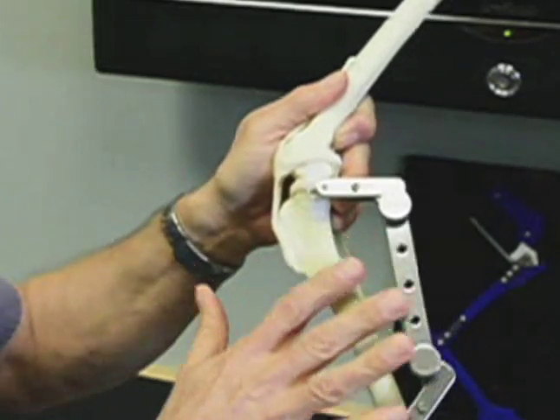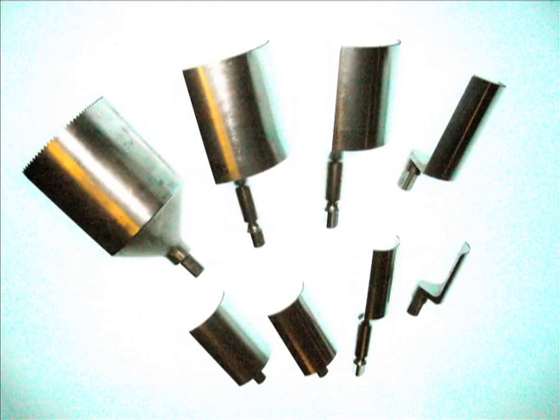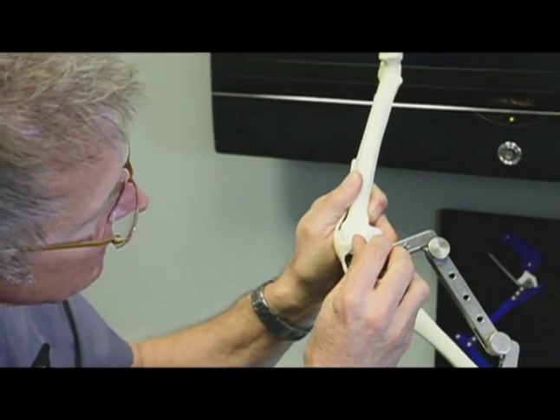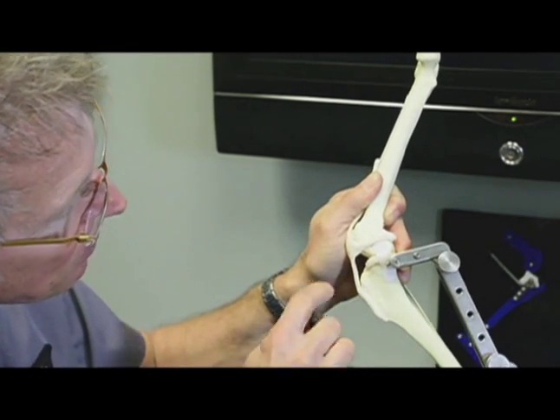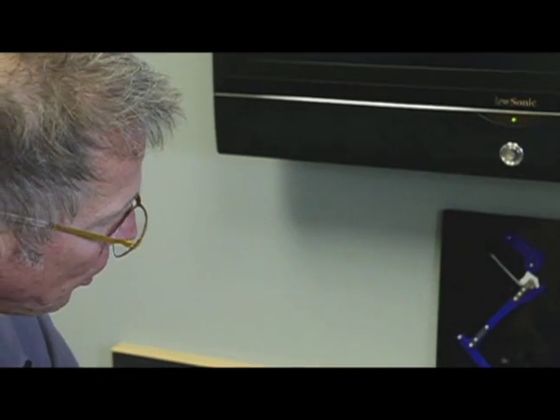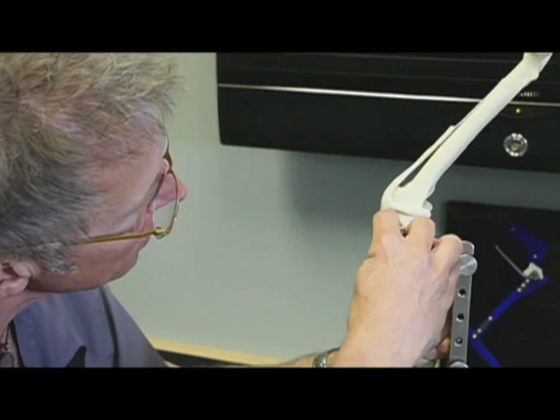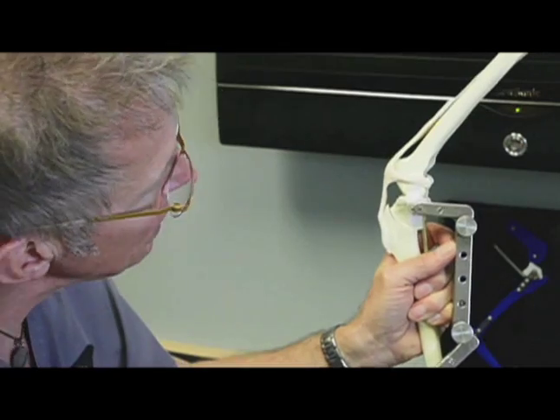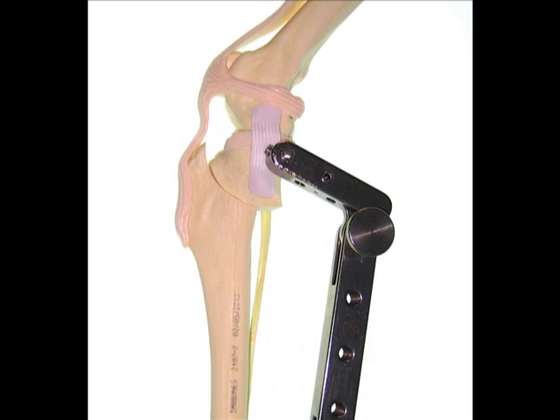So once we have the jig in place, then we'll use an oscillating saw. We have a variety of these saw blades, in fact about 10 different sizes, and we can place them appropriately on the bone, and they just vibrate and oscillate in a fine motion to make a very precise cut. So that's what the next model shows. We've performed the osteotomy, and you can see where it was performed, and we see that section of bone now we can rotate. Based on preoperative measurements, we rotate it an appropriate amount, and then with it in that new level position, we fix it in place with a bone plate.